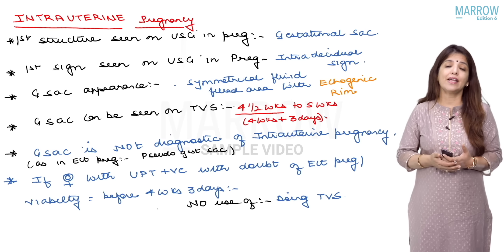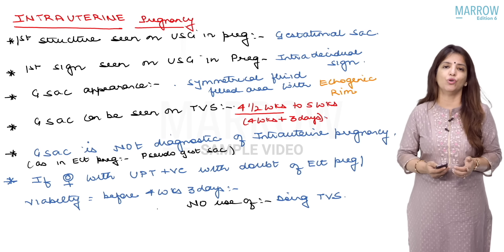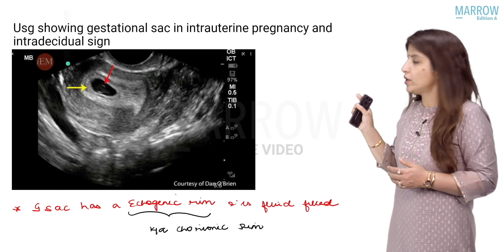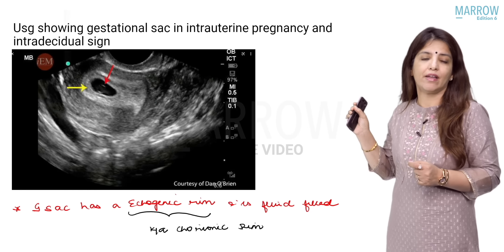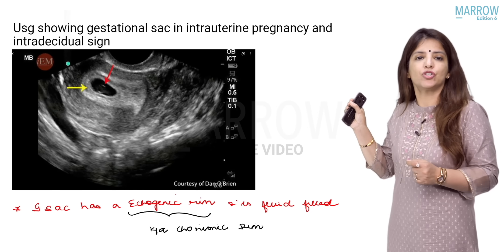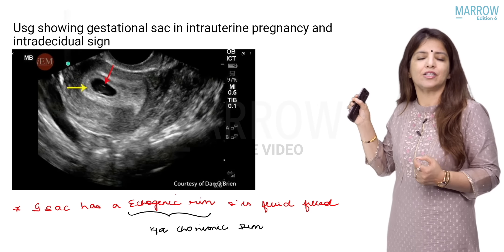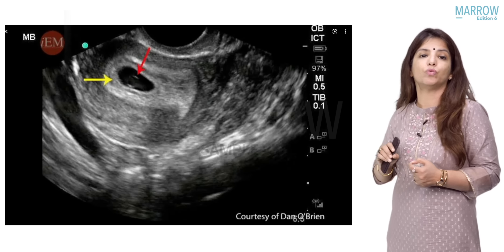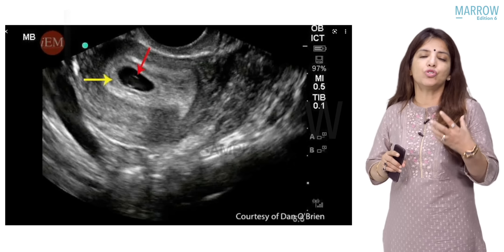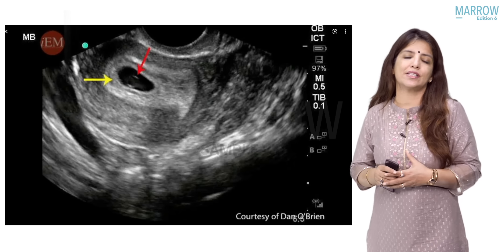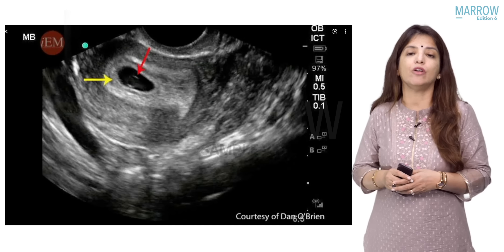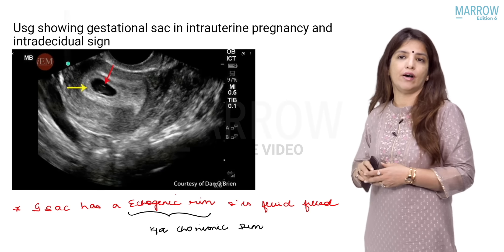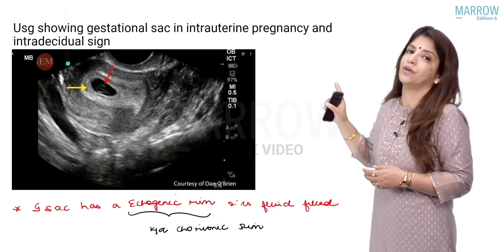In this image, the red color arrow is pointing towards the fluid which is in the cavity — that black color area is a fluid-filled cavity. The yellow arrow is pointing towards the whitish structure surrounding this black fluid-filled cavity. This is the gestational sac: a symmetrical fluid-filled cavity with an echogenic rim, and this echogenic rim of the gestational sac is called the chorionic rim.